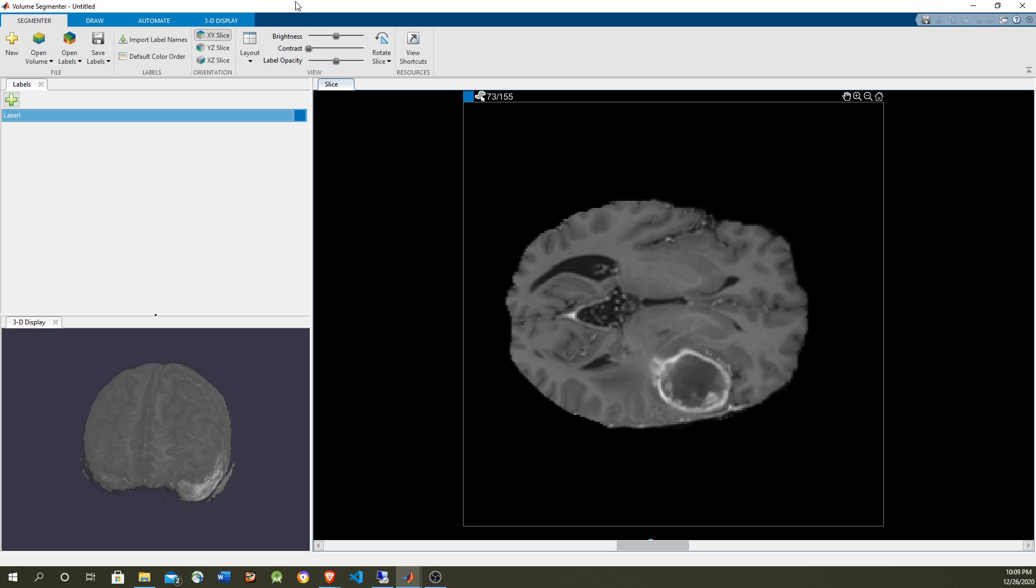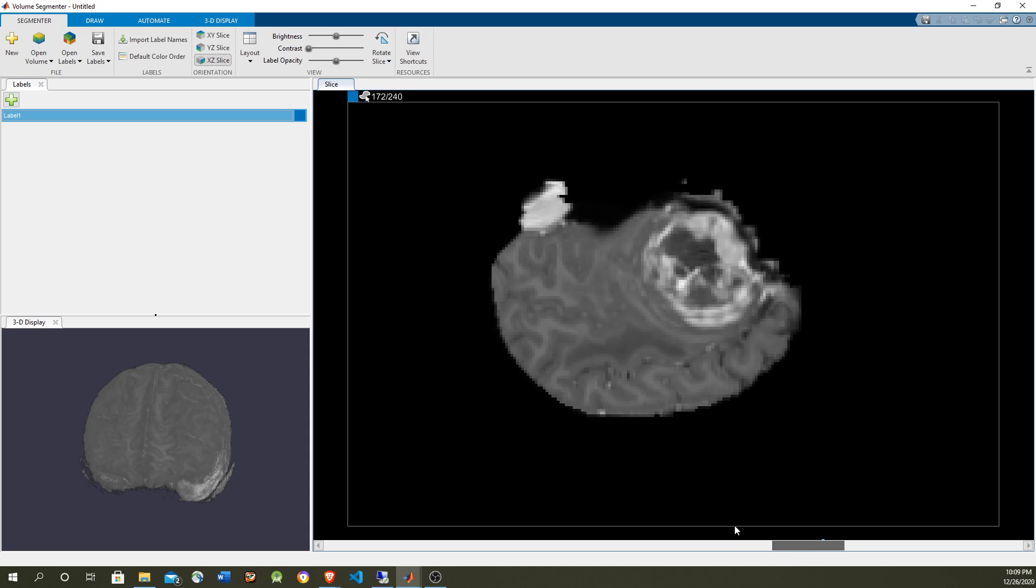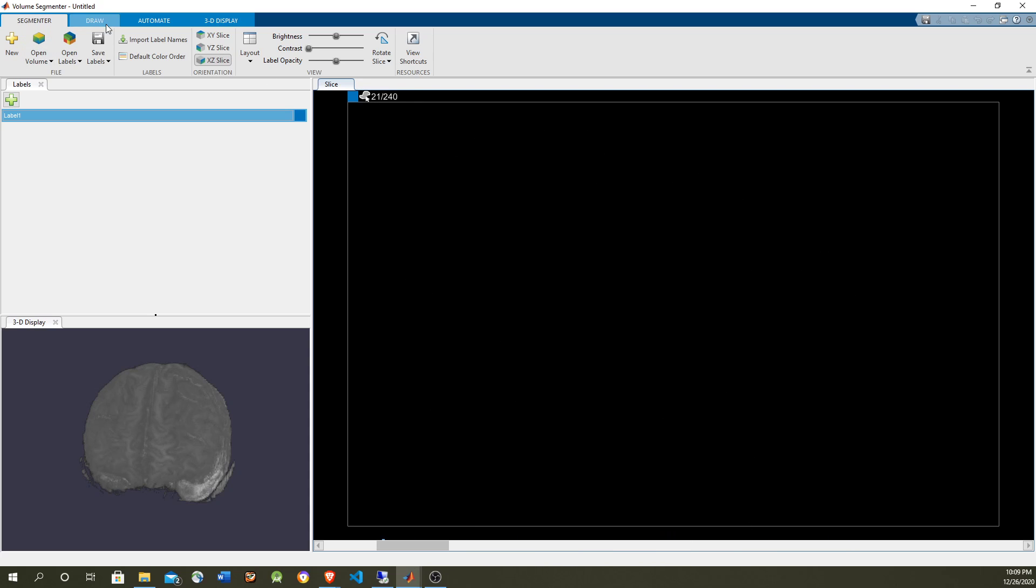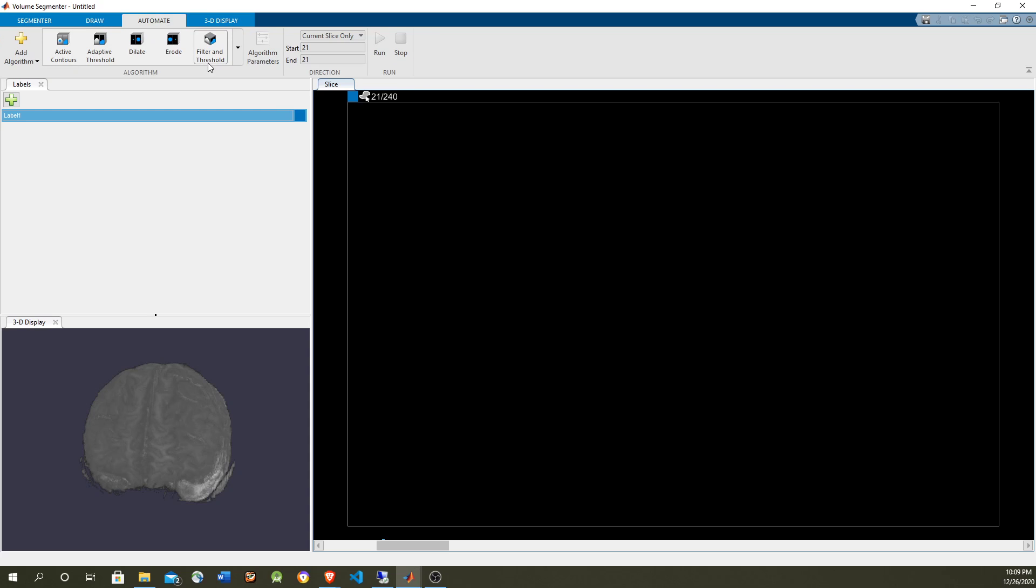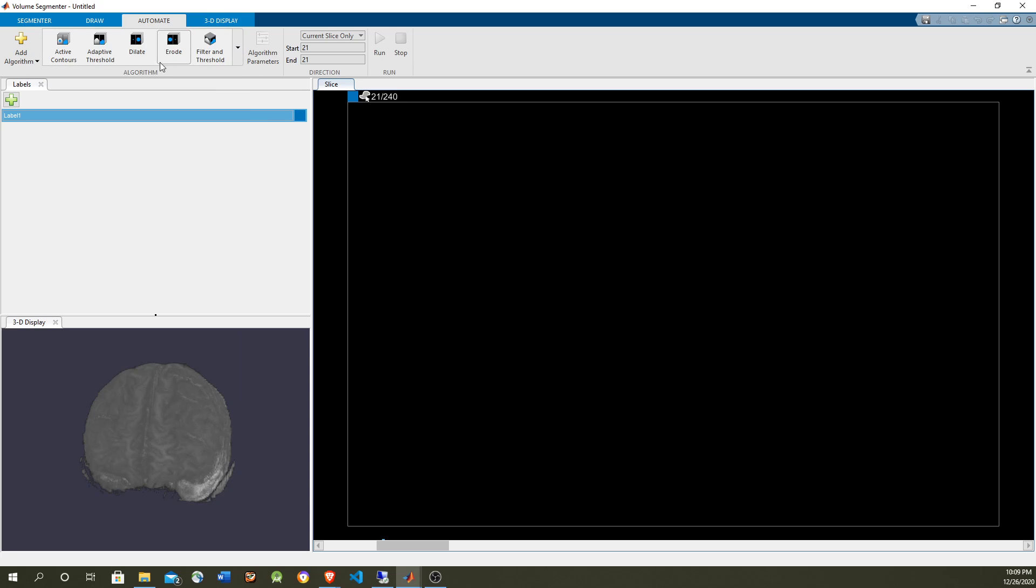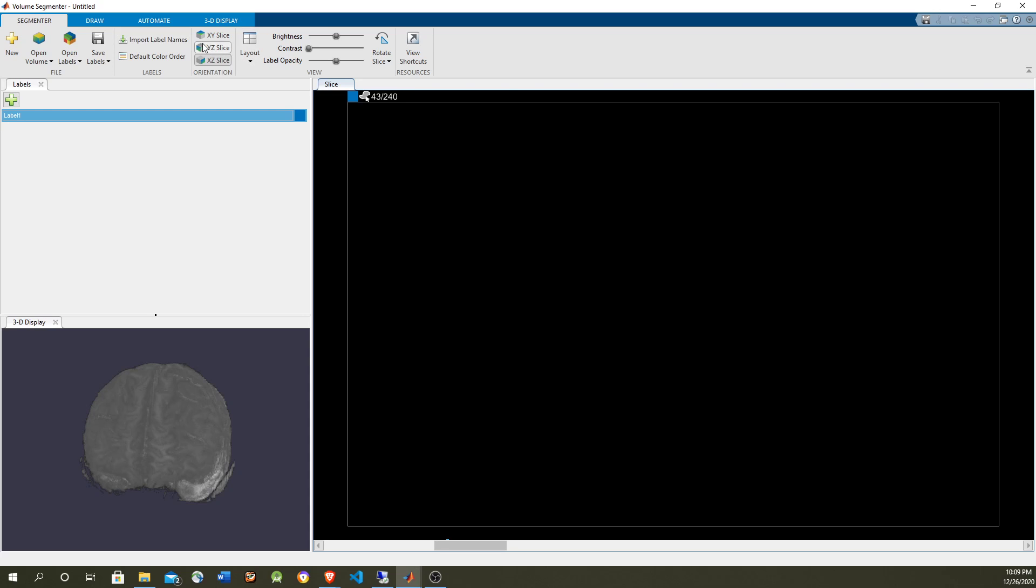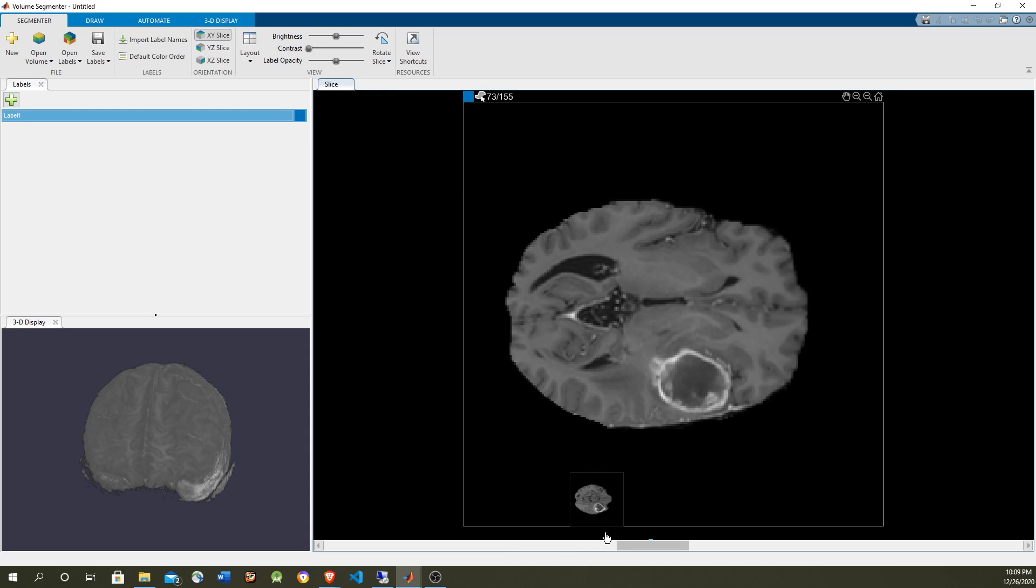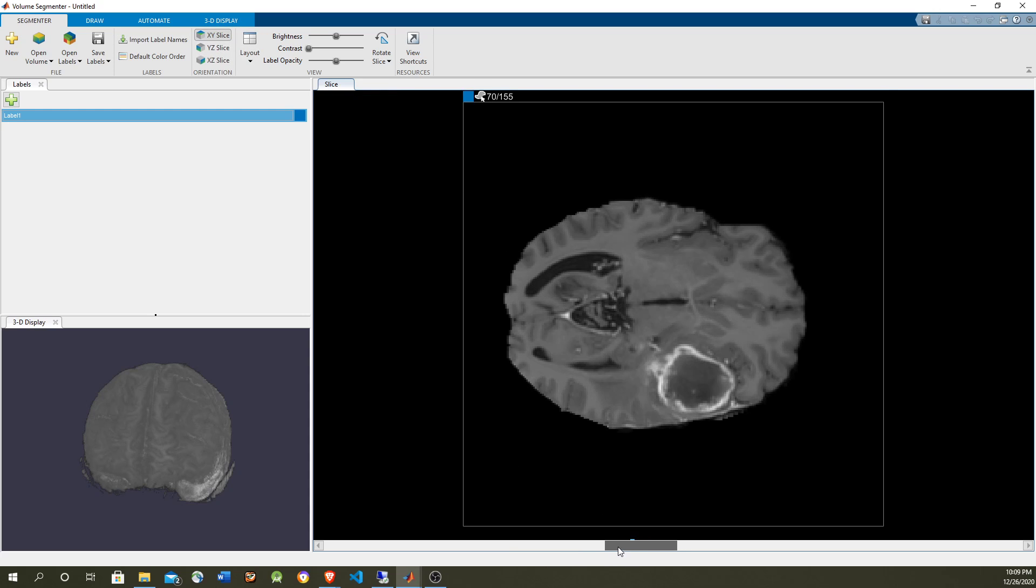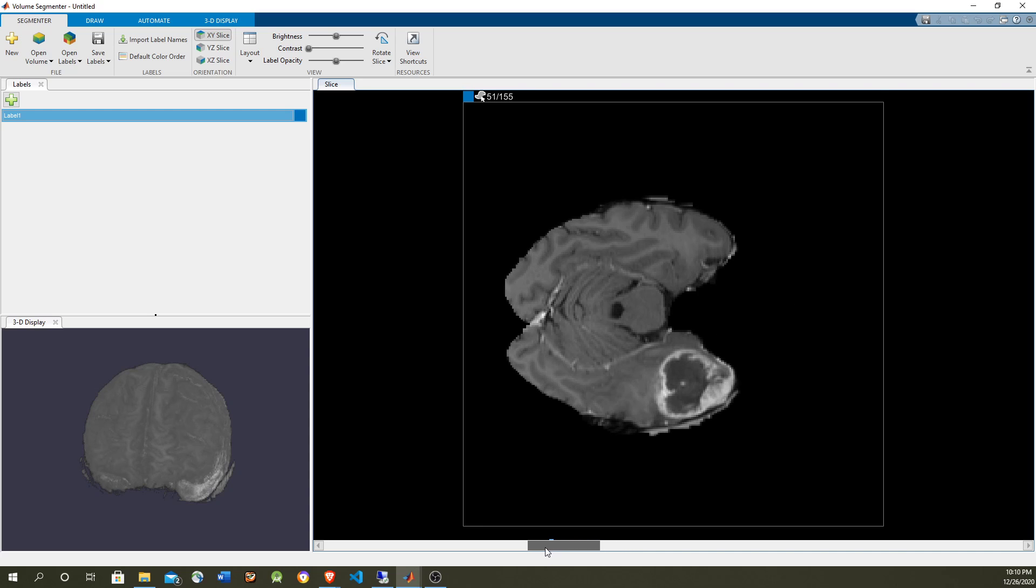Here is the planes, you can see this in the XY plane and here is the tumor. But you can also select other planes as well and do the same. This segmenter has some image processing commands like erode, dilate, fill, and you can export this as a script later to do the segmentation. Although that could also be done with deep learning, let's do it manually just to provide the data for deep learning. Let's make sure I'm in the XY slides and let's pick up where the tumor appears.